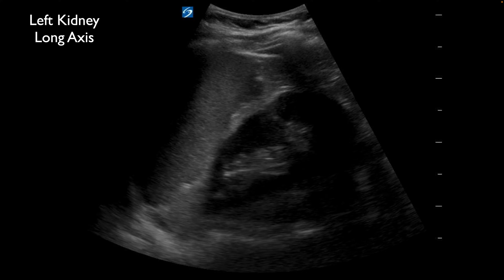We're going to start — this patient has right ureterolithiasis — but I like to always start imaging with their non-affected side. So if they have right-sided flank pain I'm going to look at the left kidney first, and if they have left-sided flank pain I'm going to look at the right. This gives me a chance to evaluate the kidney and see what their normal looks like. Most kidneys are going to look the same, however sometimes we can have some prominent vasculature in the area that can be confused for hydronephrosis, and starting on the normal side allows me to compare.